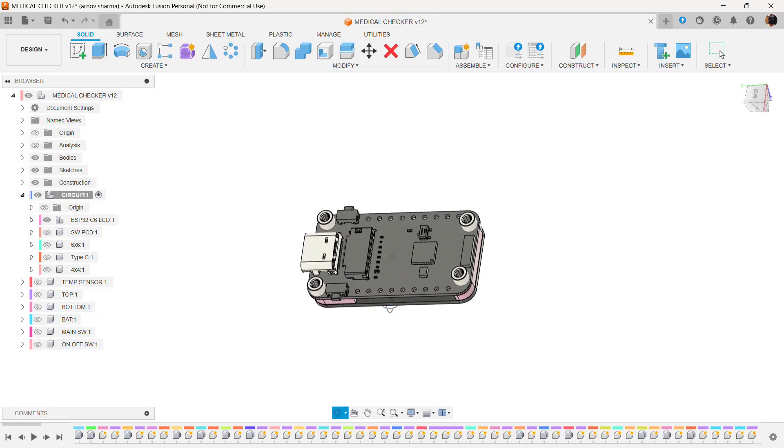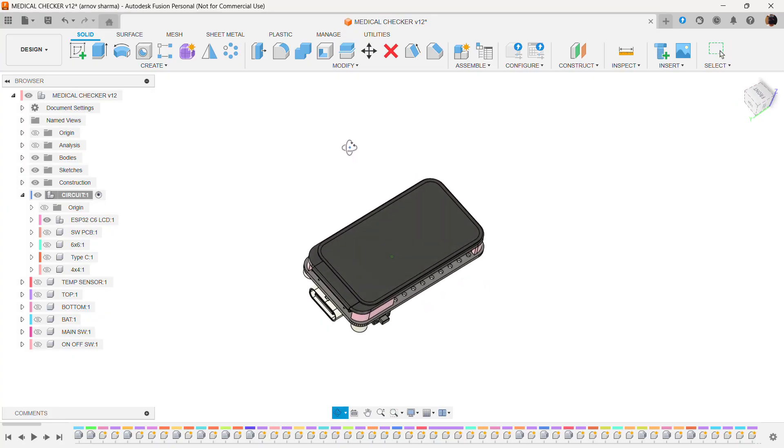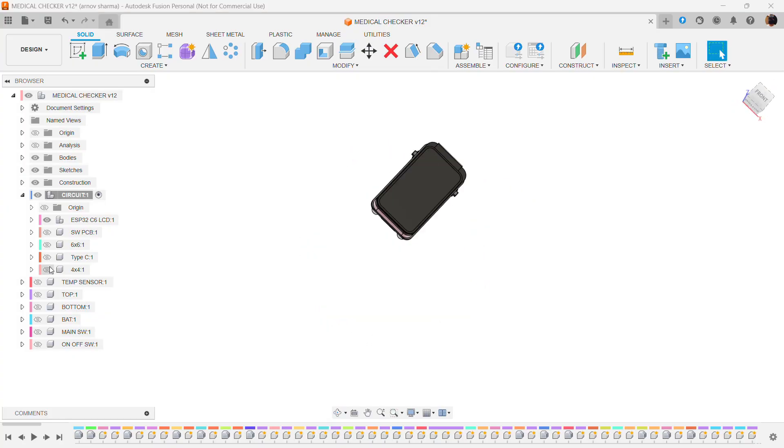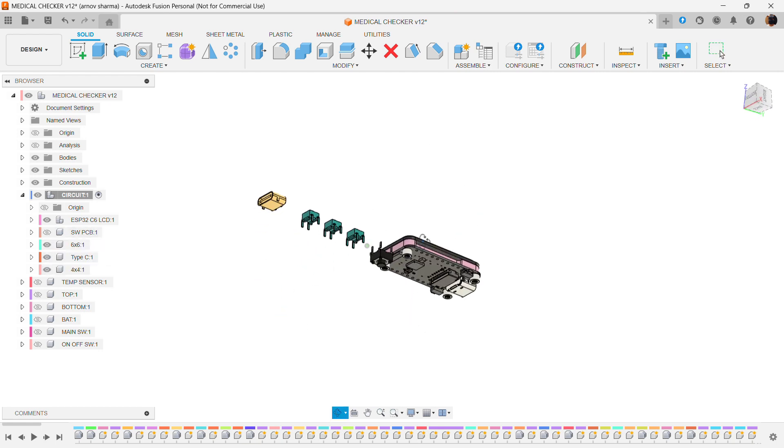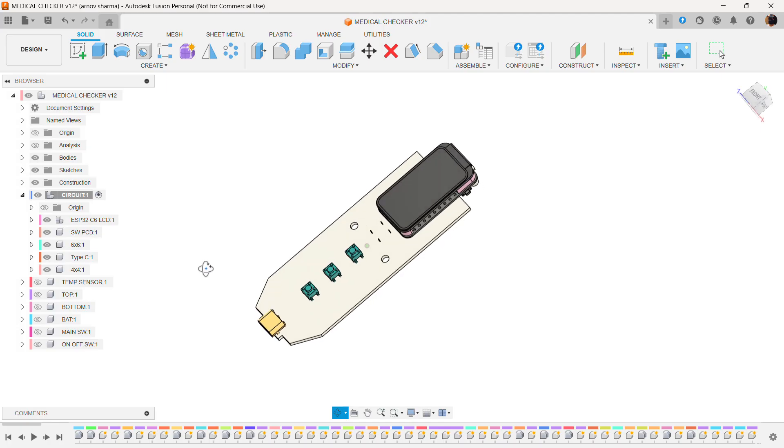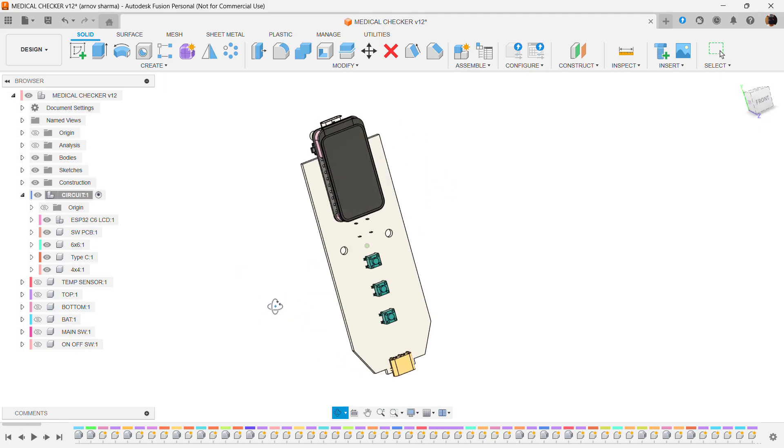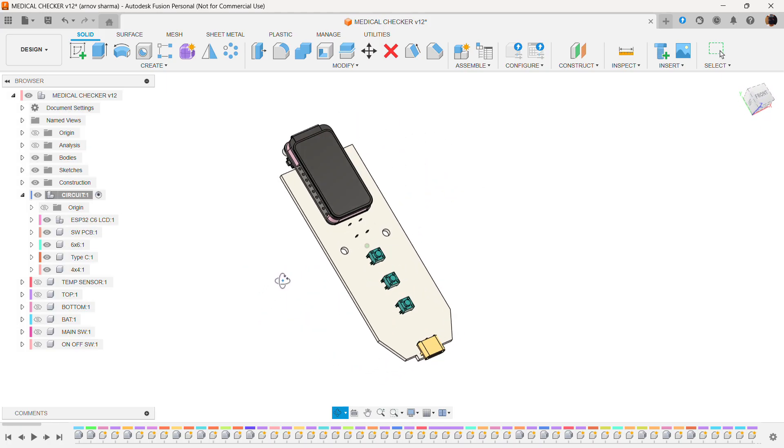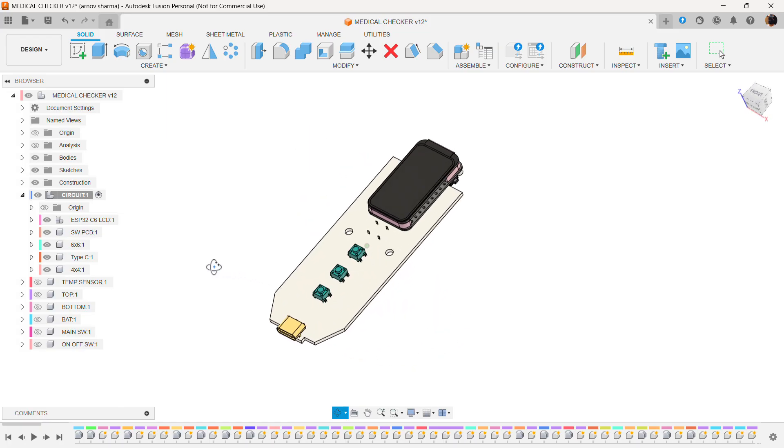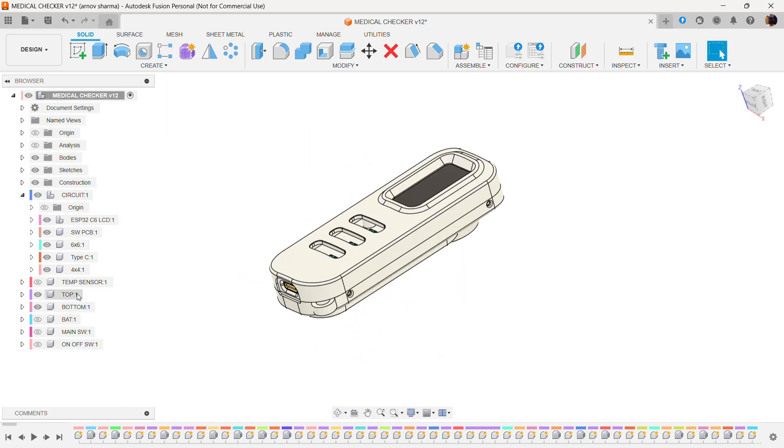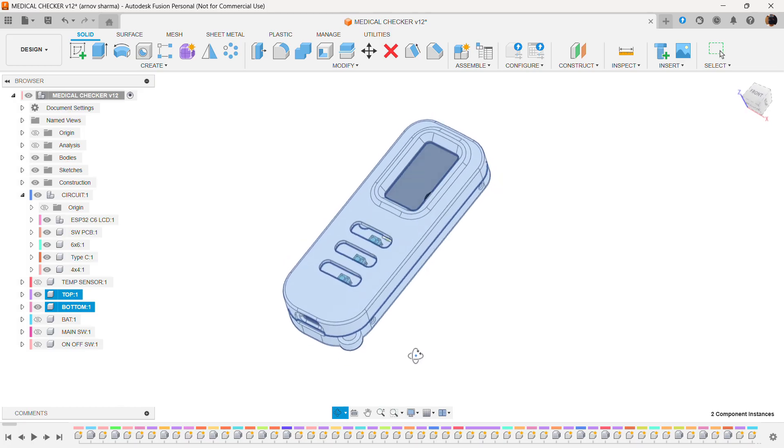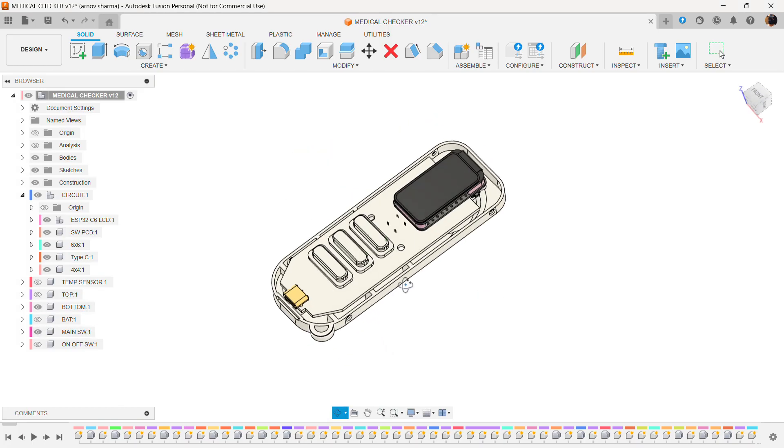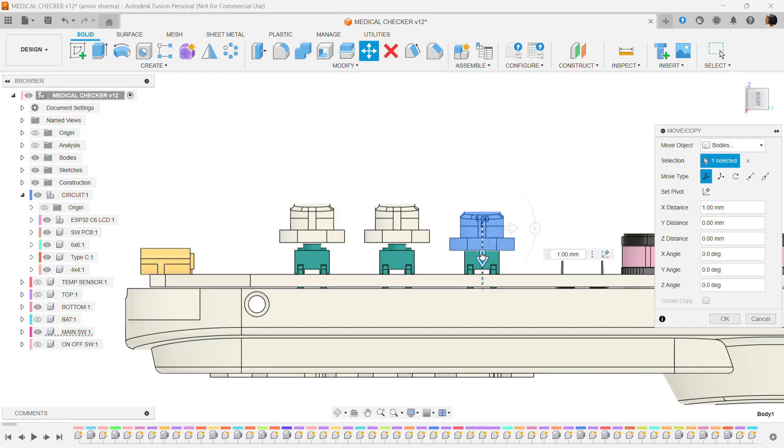To begin, I imported the ESP32-C6 board model into Fusion 360 along with models for the Type-C port and push buttons. Using these references, I laid out a long PCB. The display sits at the top, the buttons are placed in the center, and the USB Type-C port is placed at the bottom. The enclosure was designed around this PCB layout, and I added three button actuators that align directly above the push buttons. Pressing the actuator triggers the switch underneath.